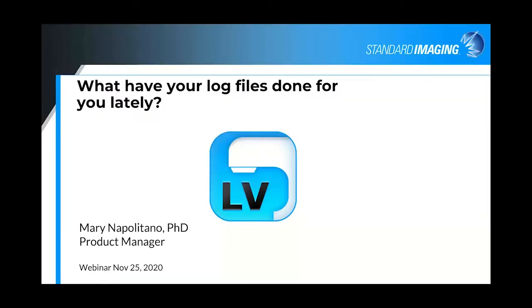My name is Mary Napolitano, and the topic for today's webinar is, what have your log files done for you lately? Standard Imaging has a Logfile-based patient plan QA solution, LinacView, that provides enlightening information concerning your plan delivery.